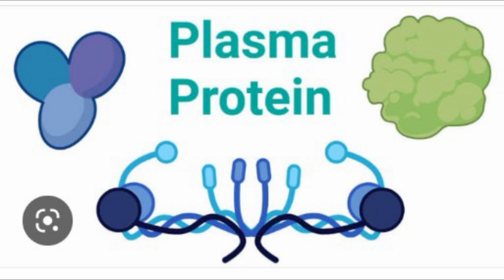Introduction. The determination of total protein content in the urine is important in the evaluation of kidney function and in the diagnosis of kidney diseases, such as nephrosis and diabetic nephropathy. In the diagnosis of meningitis, cerebral hemorrhages and others, the determination of total protein content in the cerebral fluid is beneficial along with the quantitation of glucose and chloride.